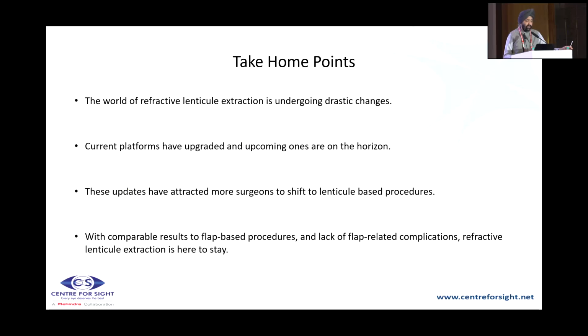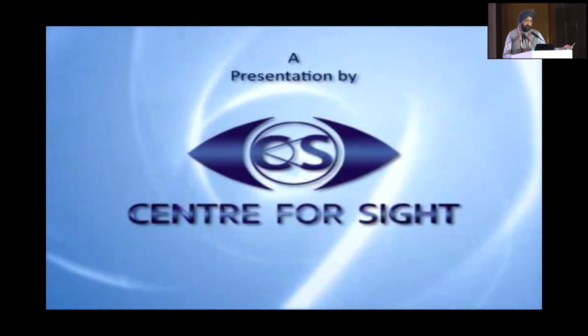So I would say the world of refractive surgery, lenticule extraction is undergoing drastic changes. Current platforms have upgraded and upcoming ones are on the horizon. And these updates have attracted more surgeons to shift to lenticular-based procedures with comparable or even better results as compared to flap-based procedures. No flap-related complications, possibly better biomechanical strength, less dry eye and less induced aberrations. I think refractive lenticule is here to stay. Thank you very much for your kind attention.